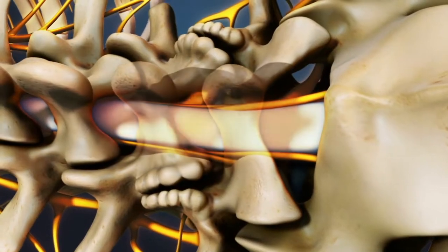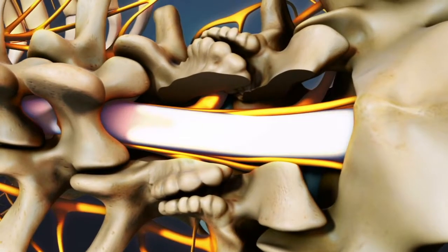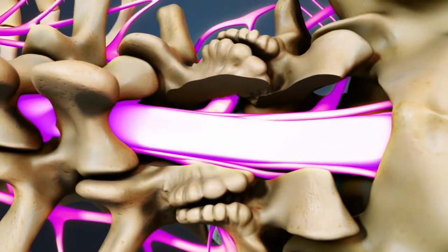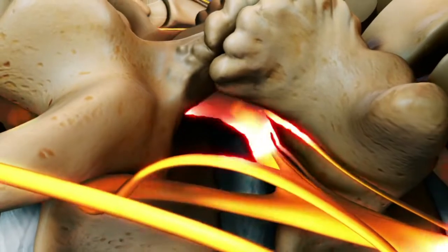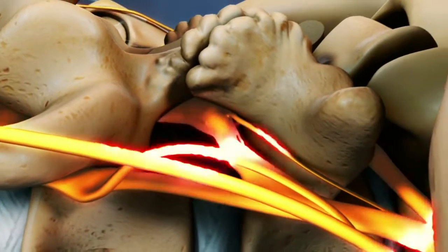After the spine is approached, the lamina is removed, allowing visualization of the nerve roots. The facet joints, which are directly over the nerve roots, may then be undercut or trimmed to give the nerve roots more room.